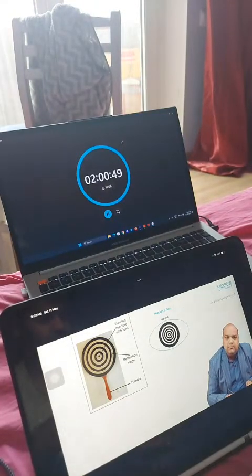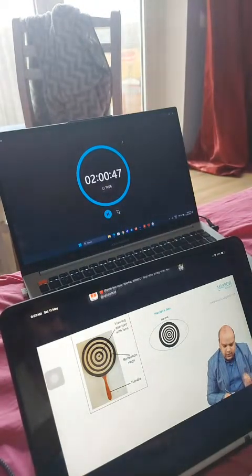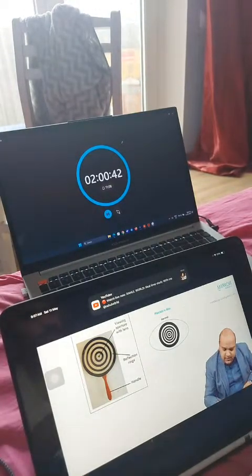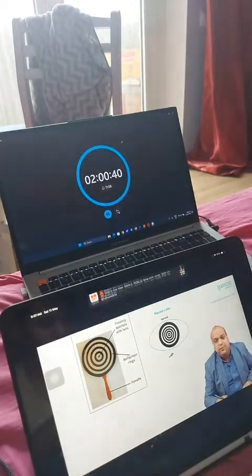This is a viewing aperture in the center with a lens. This is the handle which we are holding. Reflection. When we throw light on these rings, they reflect their image onto the patient's cornea, as you will be able to see in the image on the right side.